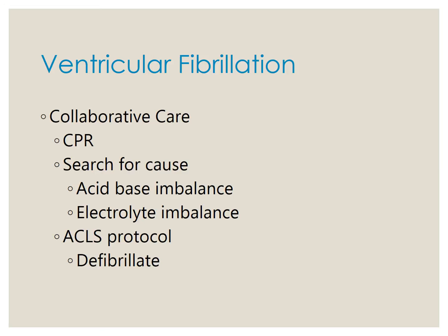When you prepare to defibrillate anyone, you want to make sure everyone is clear of the client. Because if you are leaning up on that gurney and you defibrillate, guess what? That conduction is going to go through. It's going to shock you also. So when you VFib, you defib, you want to make sure everyone's clear. Okay, everyone has to step away. They have to stop doing chest compressions for a second and make sure you're not leaning on that gurney next to the client. And then you defibrillate, and then you go right back down on that chest and do compressions.